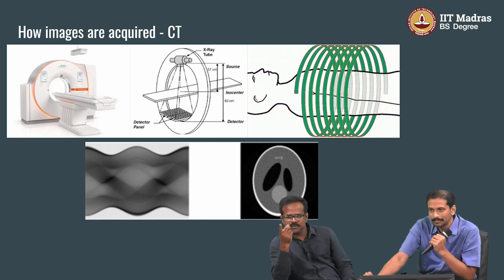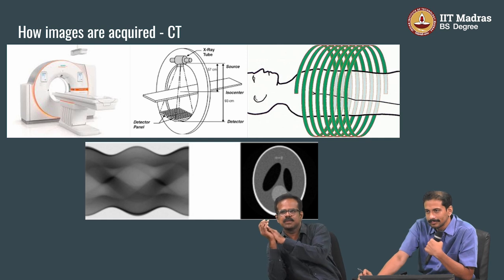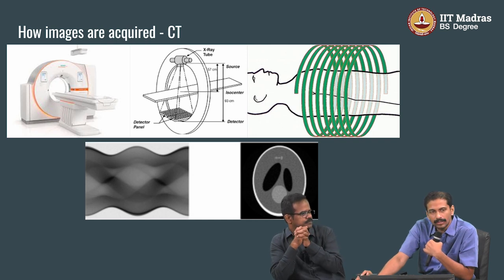And coming to the radiation problem, this is a logistical problem: how to give minimum radiation and get maximum output. For this also, we are using computing power and data science. So we will highlight those potential roles where data science helps. Along the way, I am just highlighting some of the areas, but comprehensively we will tell later also. Okay, so let's move on to a third modality, which is CT scan.